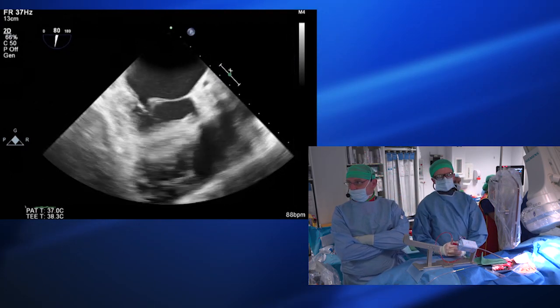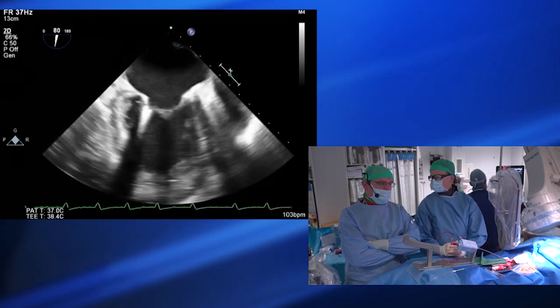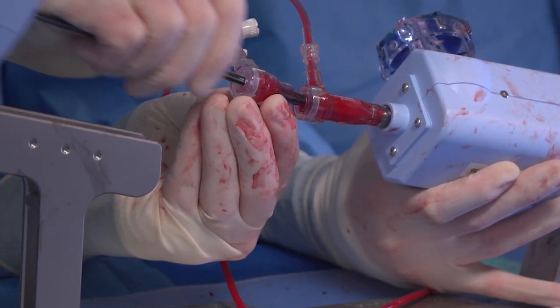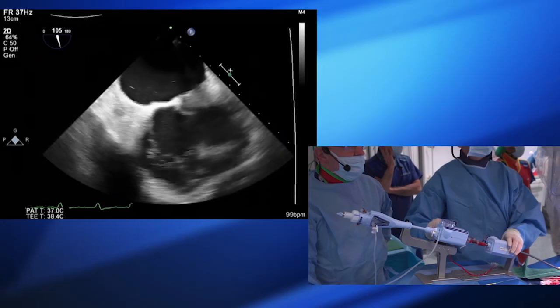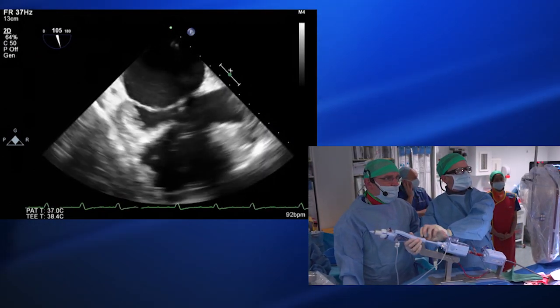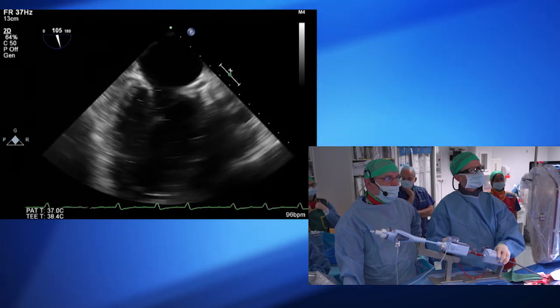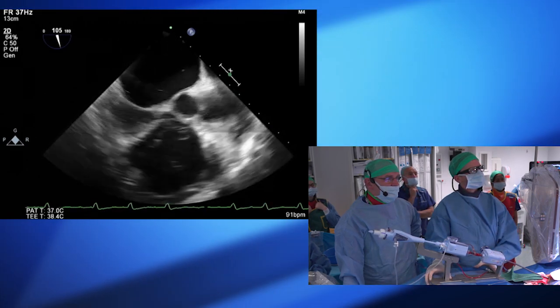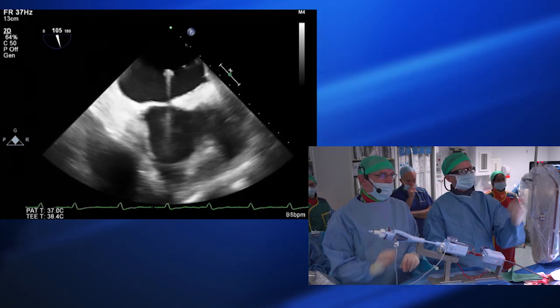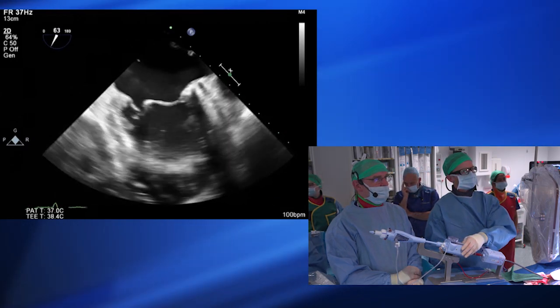It's a very haemodynamically benign procedure — the only thing that really happens is the blood pressure goes up a bit as you close the clip. Now, as before, it's mostly M knob and posterior torque. Feels like we're stuck — yeah, we just caught on the ridge there. Very often you catch the Coumadin ridge, and by pulling everything back, suddenly everything's free. As long as you're aware of that, it's very easy to fix.